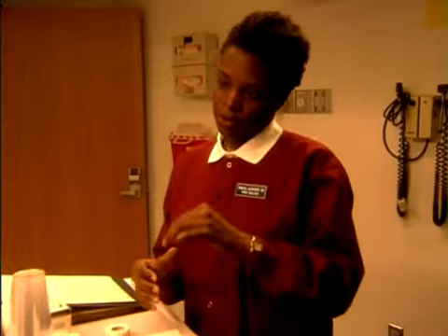That means the pharmacy mixed the medication in a syringe. So I'll be inserting the syringe into the pump, which is connected to the primary infusion tubing. And the pump delivers the medication using a mechanical pressure applied to the syringe plunger. You seem pretty comfortable with the procedure. Ready to administer?